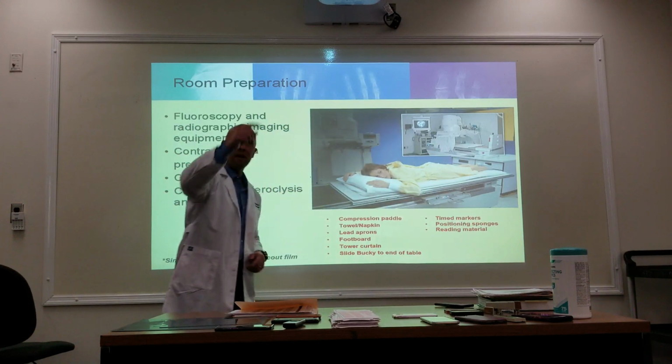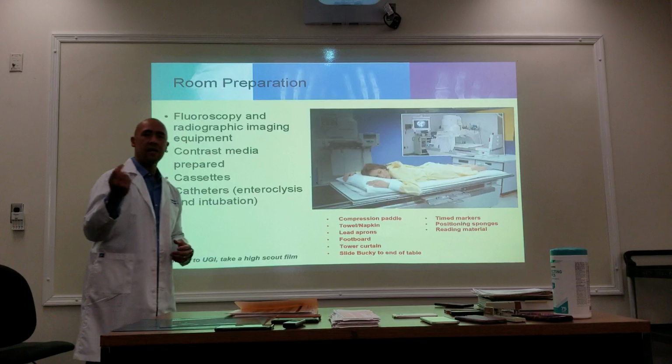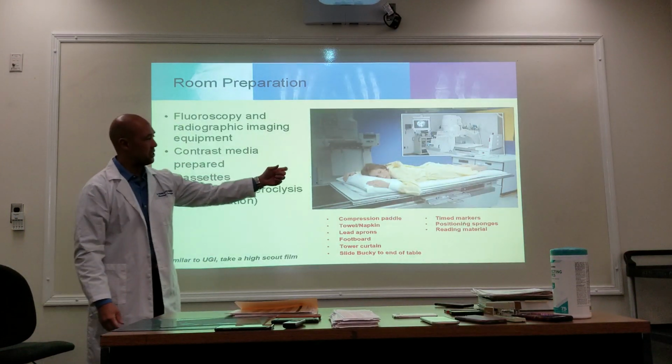We have tower curtain in the back room, right? Mm-hmm. Okay, tower curtain. So that protects the doctor and the technologist from scatter radiation.